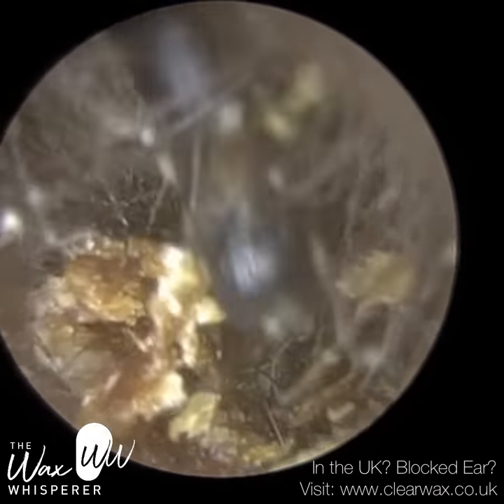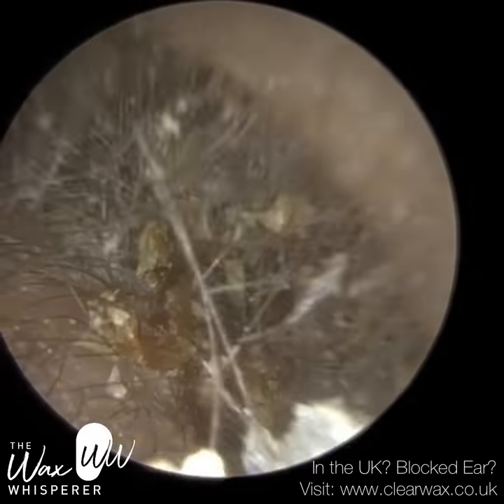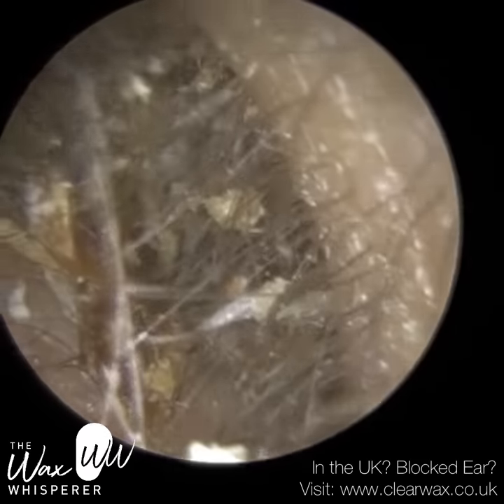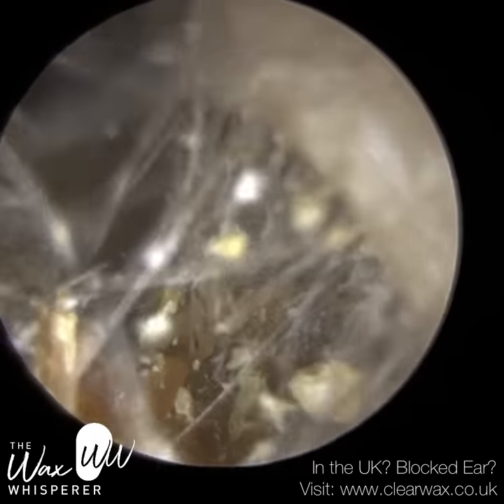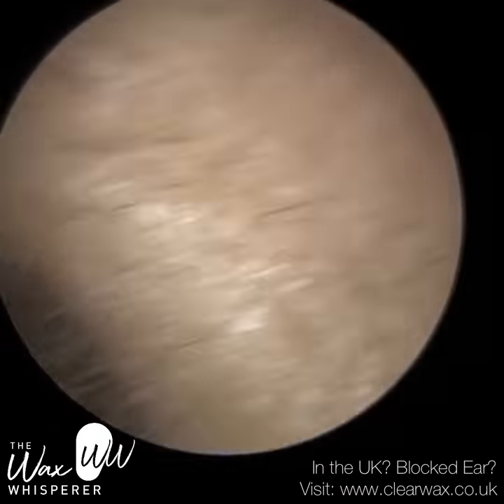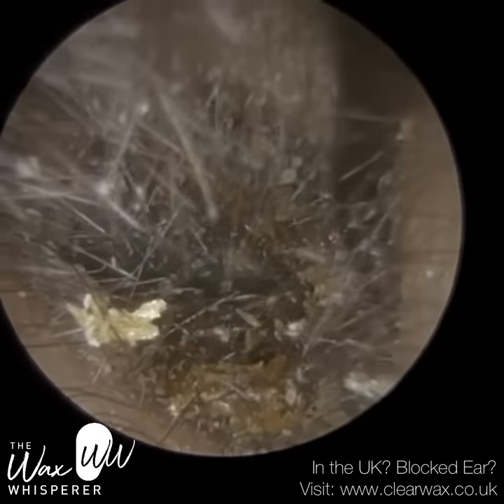I actually sometimes find harder dry wax a bit easier to remove because quite often you can remove it in large chunks. With softer wax, it can come away in little pieces and just prolong the procedure. However, although this wax in this patient's ear is really dry, it didn't come out in big chunks as I was hoping.